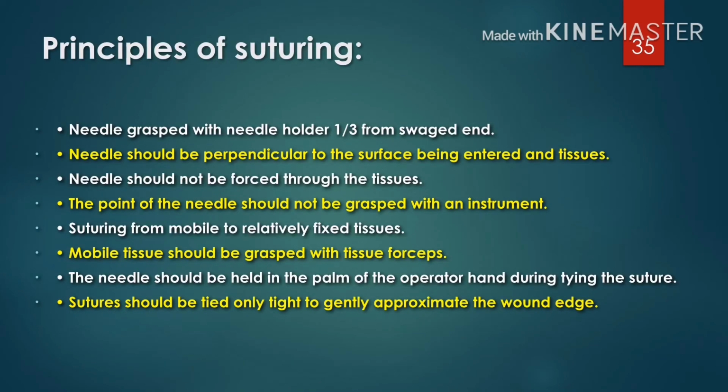Principles of suturing. The needle should be grasped with the needle holder one-third from the swaged end. The needle should be perpendicular to the surface being entered in the tissues. The needle should not be forced through the tissues. The point of the needle should not be grasped with an instrument.